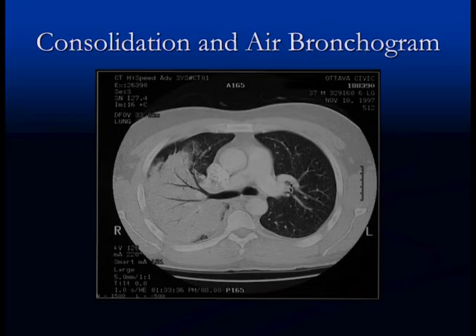Another change we look for in consolidation with airspace disease is an air bronchogram. Here a lobar pneumonia shows the bronchus coming out into the pneumonia and branching — those black branching lines are called an air bronchogram, which is another characteristic of airspace consolidation.